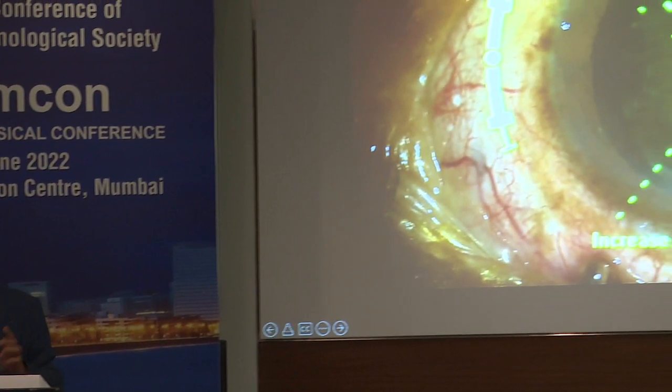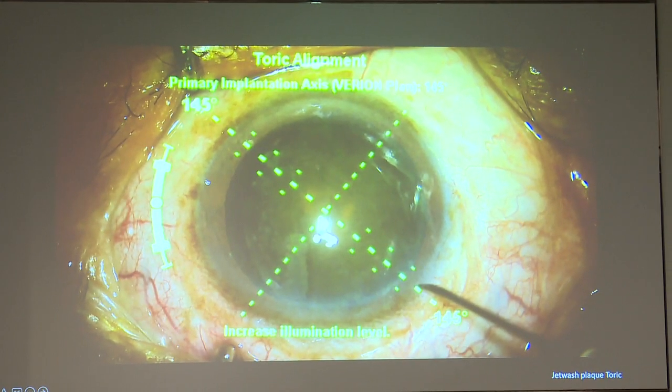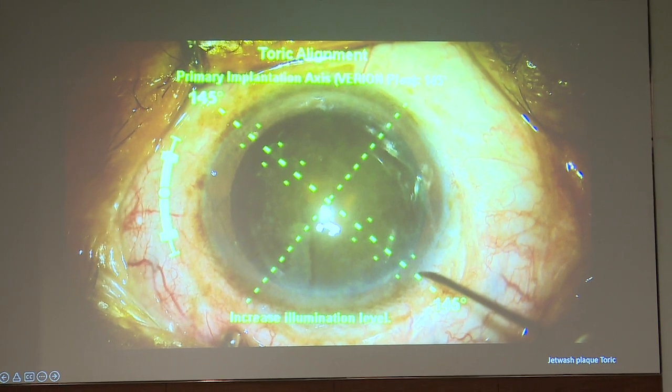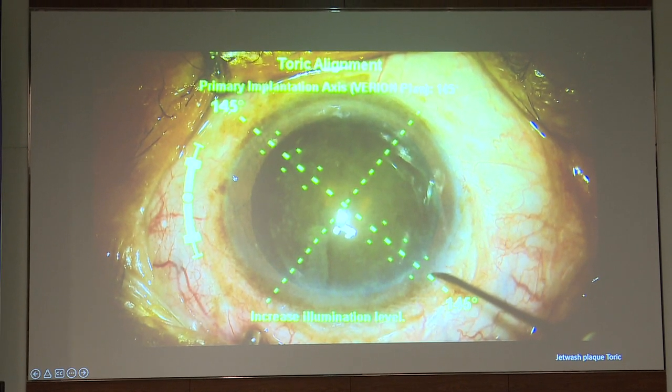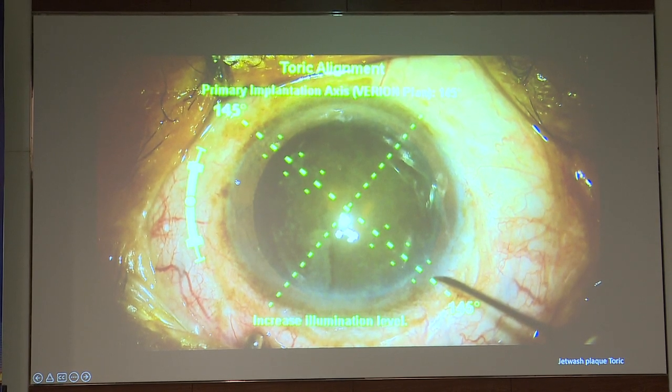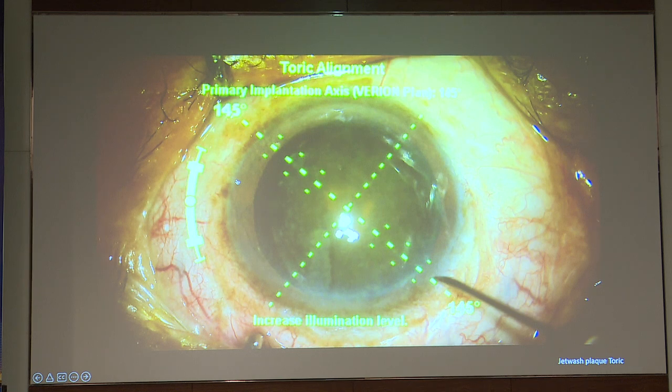So going on, this was a patient who was post vitrectomy, and challenging one because it was totally subluxated and there was a lot of phacodonesis. Fellow eye was lost to previous multiple retina surgeries almost 10 years back. So this was the only eye of the patient, and he went from 6/18 to 3/60 and then decided to get operated. It turned a brown cataract in this time, and being a vitrectomized eye, we were anticipating all the issues that you can.